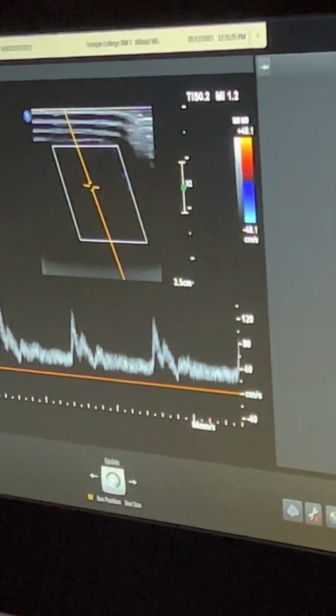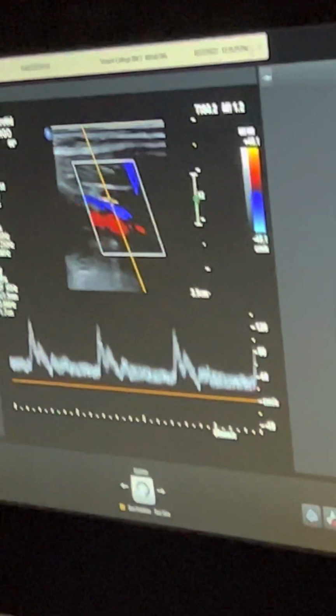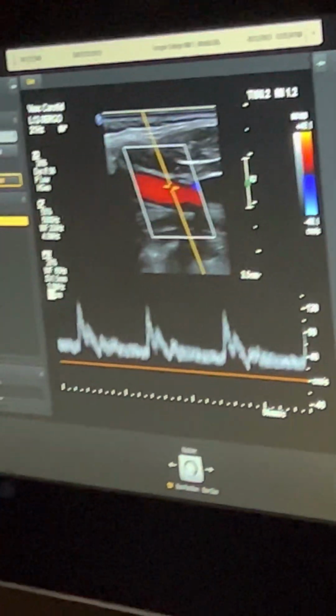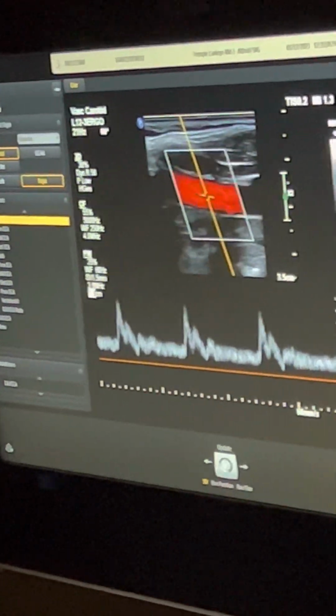She's going to show you how to put it in the package. You'll need to use the package because part of your grading process is when you're taking these velocities, you're going to have a worksheet report at the end of all the velocities the doctor needs.